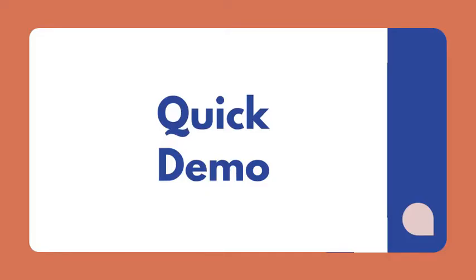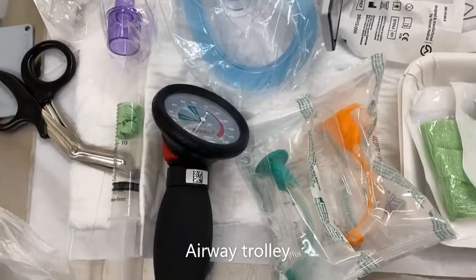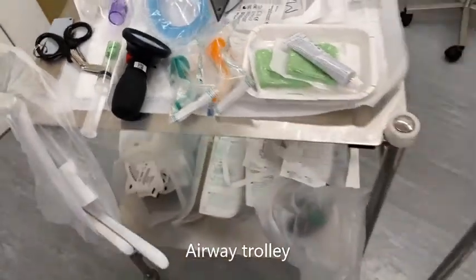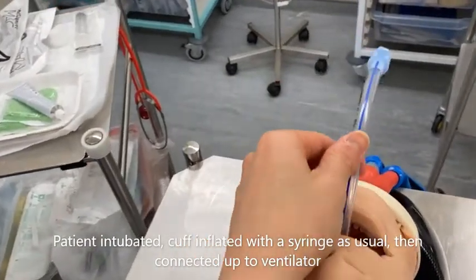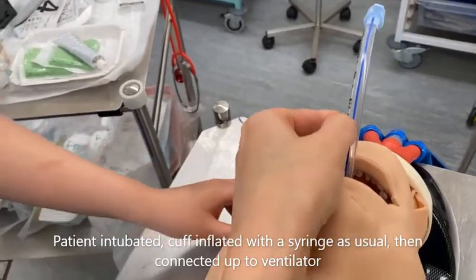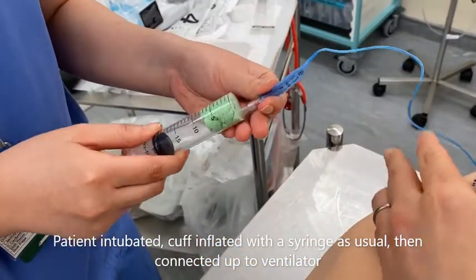We'll now move on to a quick demonstration on how to use the manometer. Your cuff manometer should be at the airway trolley. Once the patient is intubated, inflate the cuff with a pre-filled syringe as how you would normally do.